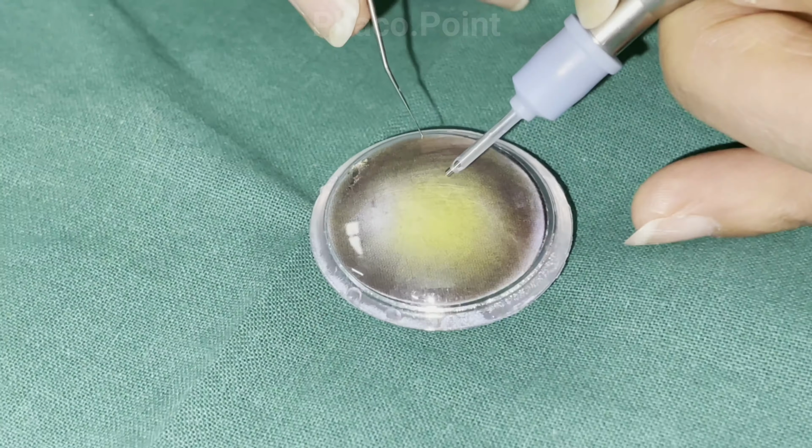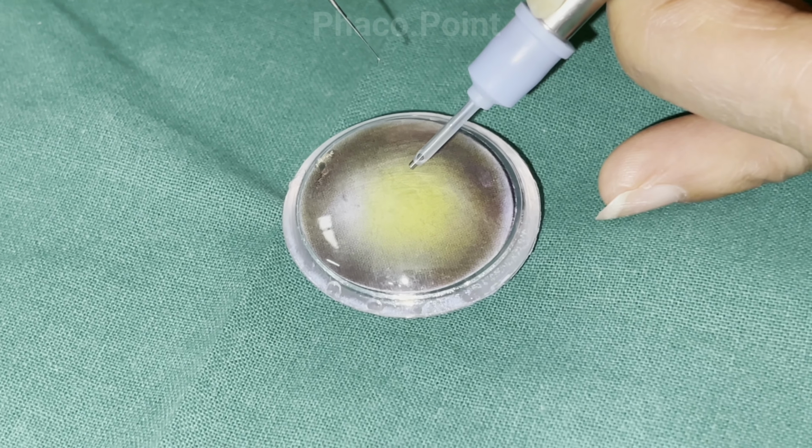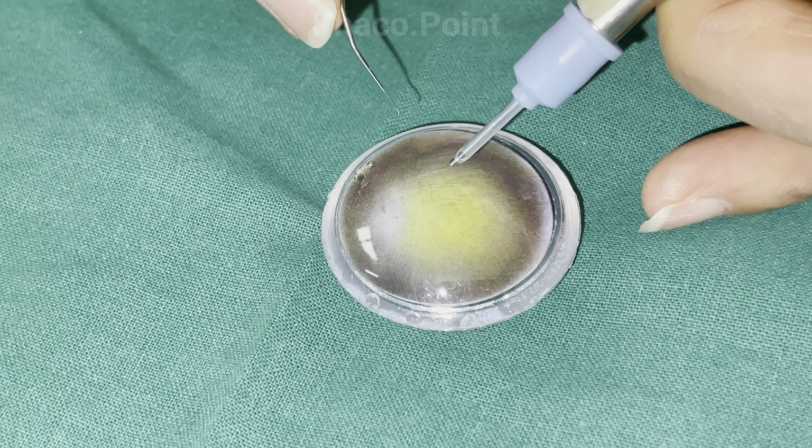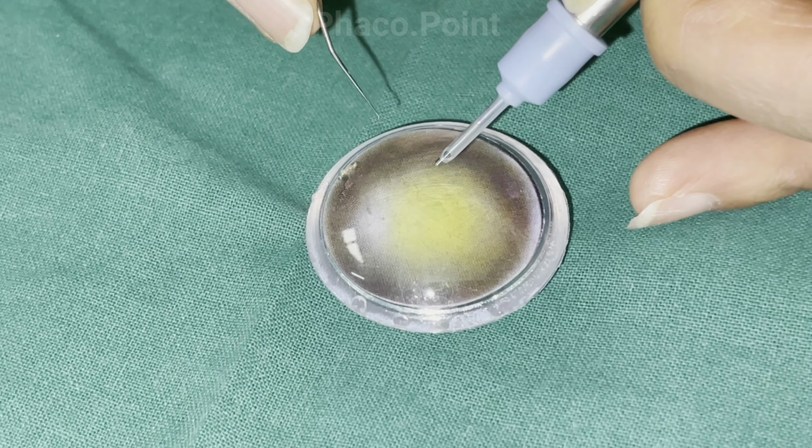Once the fracture crack is achieved, the foot pedal now goes in foot pedal 1 because we are not holding on to anything yet. This same procedure is repeated. The next heminucleus is brought around, and once more you bury into it in 3. You hold on to the buried tip in 2. Whilst maintaining hold in 2, the two fragments are separated, after which the foot pedal immediately goes into 1. In this manner, the nucleus is downsized into heminuclei and then into individual fragments.